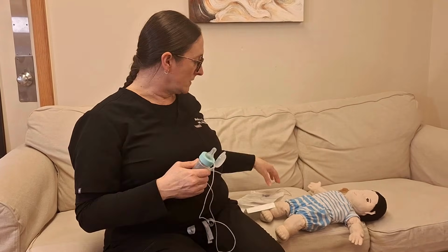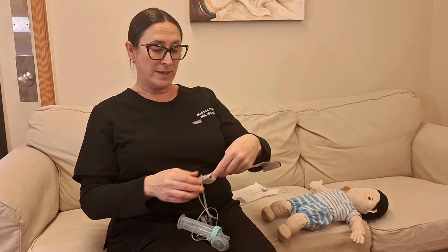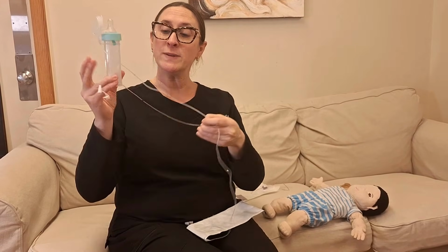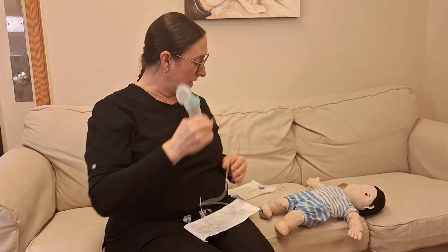The other variations that can be used, so this is a 36-inch 5 French. For babies that do need to feed a little bit more robustly or rapidly, we can use a shorter tube. Obviously, the shorter the tube, the faster it's going to flow. So if a long tube seems to be too much effort, we can use a shorter tube like this one to make it a little bit easier.